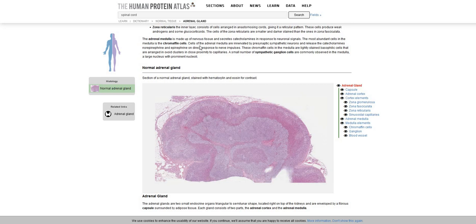The last tissue we will look at in this lab is the adrenal gland. And we, once again, are going to start from that macroscopic view, showing the whole thing, and then we will zoom in and look at the different layers. So overall, our adrenal glands are going to sit on top of our kidneys.